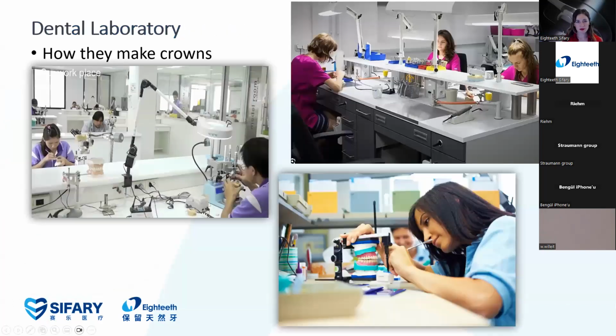This is the basic, very similar to the old dental laboratories, where they can make crowns. There are many staff actually. Minimum is 5, but mostly it's between 10 and 50 in an ordinary dental laboratory, because there are many people working on different types of restorations. They are using a lot of devices, a lot of computers and everything.